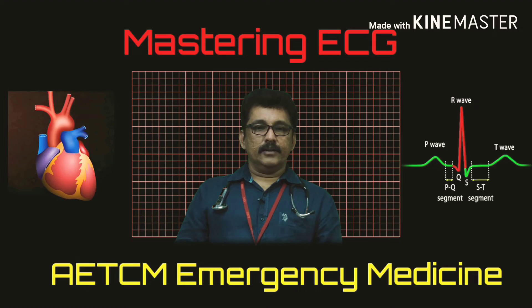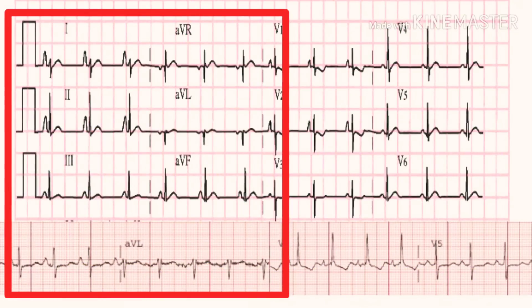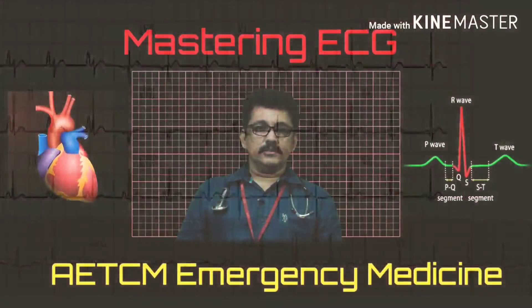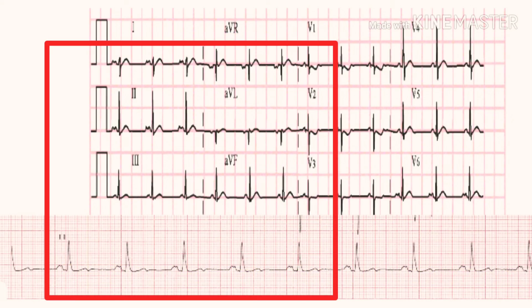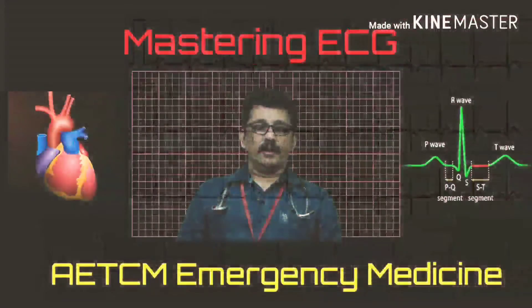This 12-lead ECG shows very tall P-waves in all leads — you can make a diagnosis of right atrial enlargement, called P-pulmonale. In this other ECG, the P-wave is bifid and notched in almost all leads — wide and notched — this is called P-mitrale, a classical finding of left atrial enlargement.